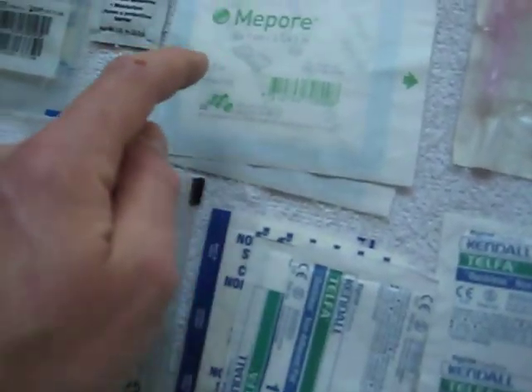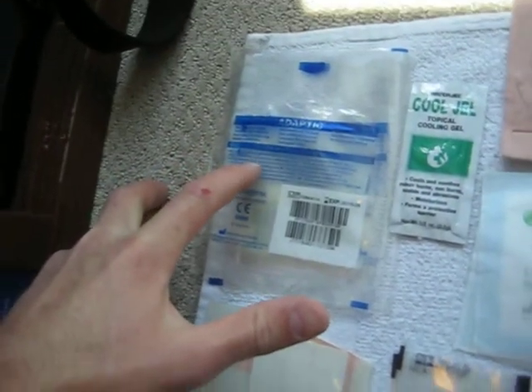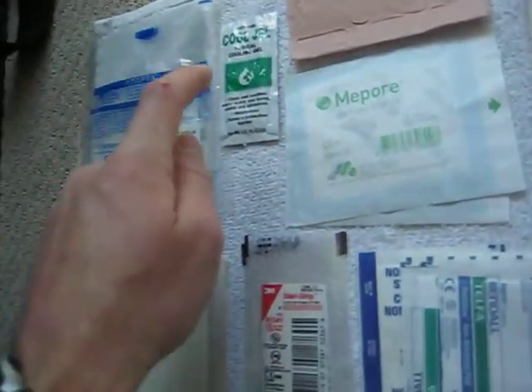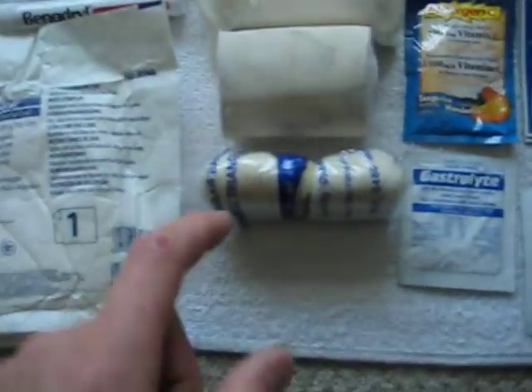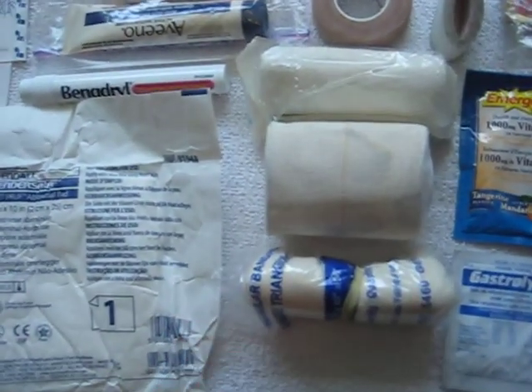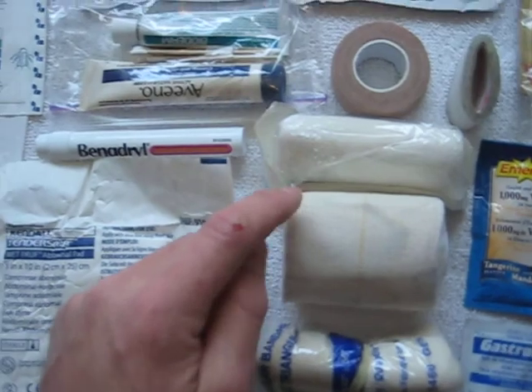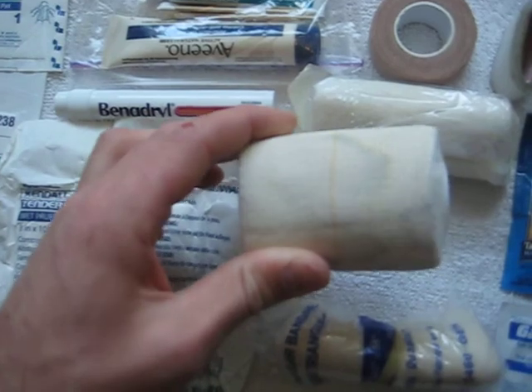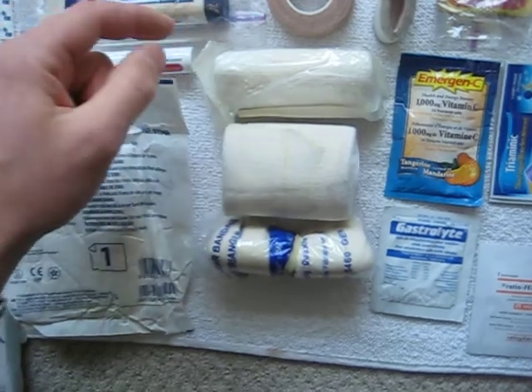Up here we got Me-Pore breathable dressing. We got basically second skin for burns and hot abrasions. Cool gel, burn gel. There's some moleskin, and for more significant wounds and also for sprains and injured arms, triangular bandage. This is like elastoplast, like kind of like an ace dressing with stickiness on one side. So it's really good for compression, especially for blown ankles.